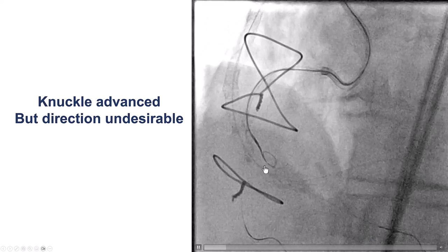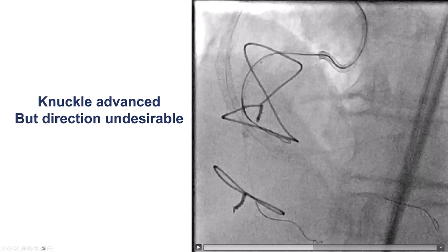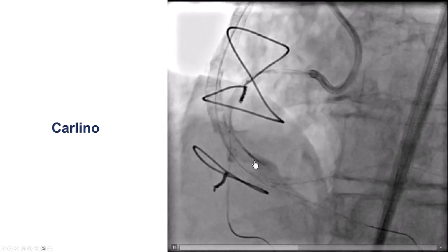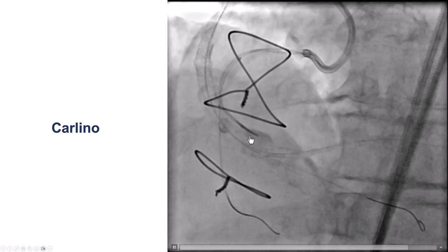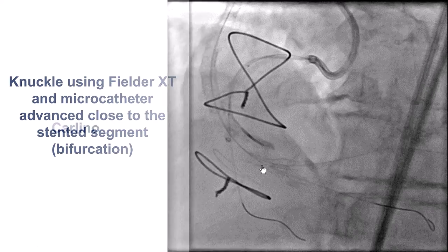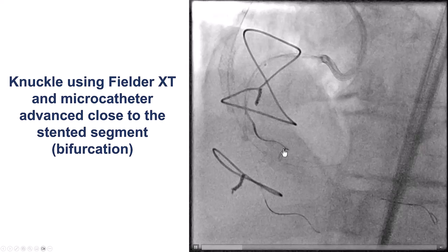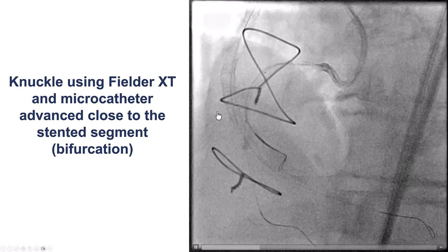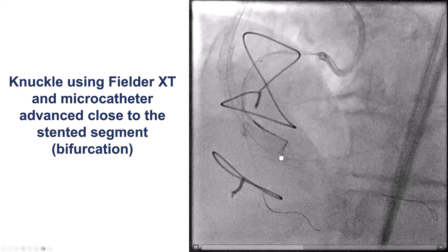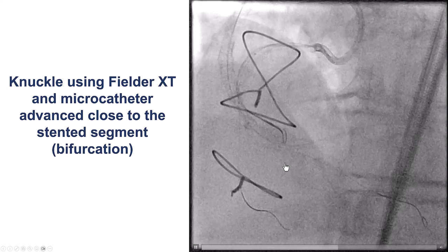We advanced the knuckle, but it became fairly large, and the direction was not exactly what we wanted, despite multiple attempts. So we decided to use the Carlino technique to clarify where we were, and there was a fairly large sub-intimal space there, which did not help us very much. We then tried different wires — a Fielder XT that forms tight knuckles — and now we were actually able to reach the native RCA just proximal to the distal bifurcation.